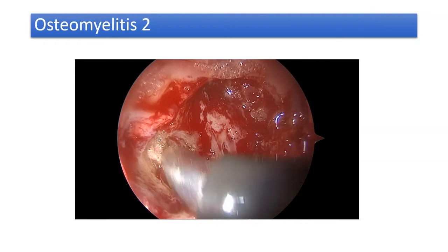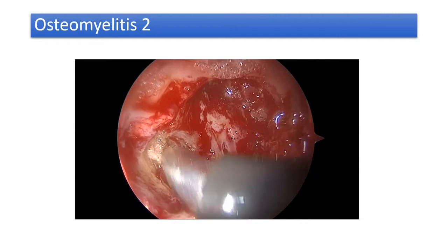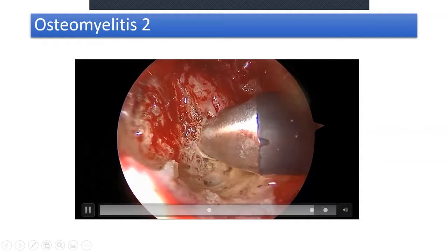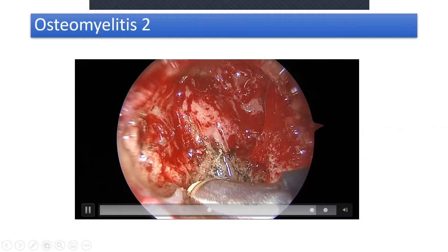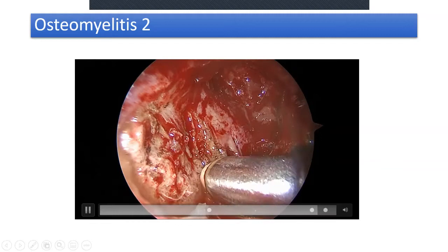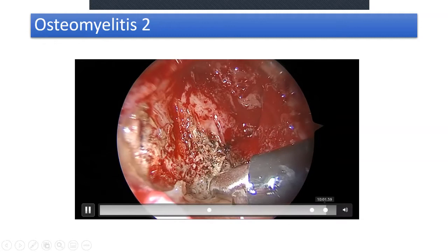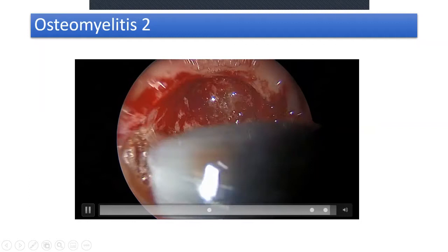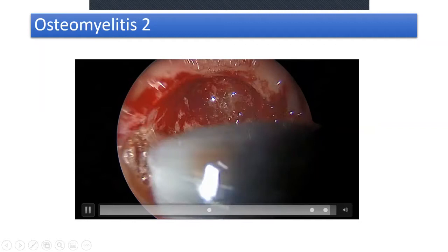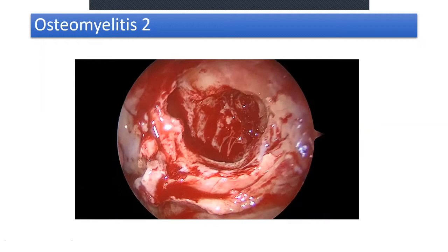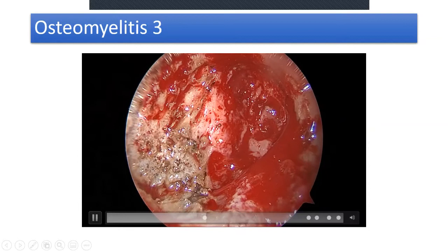You can see the entire posterior wall of the maxilla is very porous and completely diseased. Looking at the floor of the maxillary sinus, the bone quality is poor — it was so porous it was not hard at all. The entire mucosa is cleared off — the posterior medial portion was more affected than the lateral portion. Using a 70-degree scope to examine it.